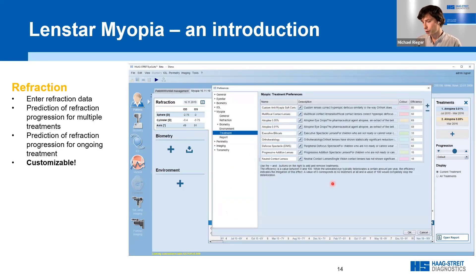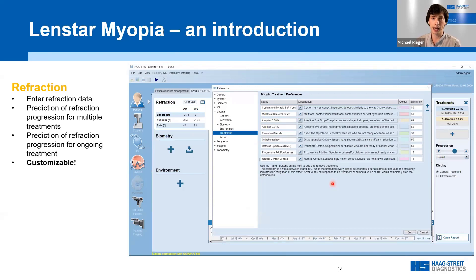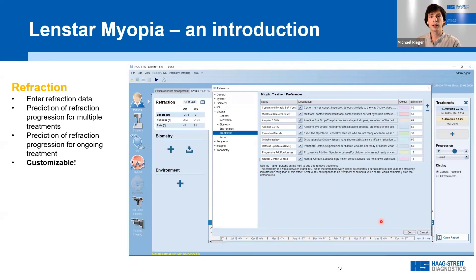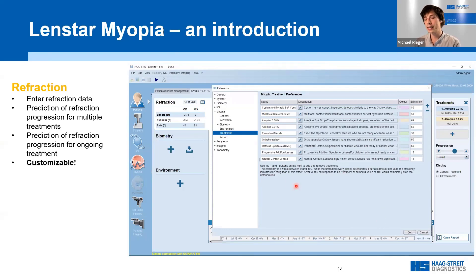The treatment curves come from a customizable list of treatments that can be entered, removed, or updated by the user. Combination therapies — for example, atropine combined with orthokeratology — can also be added, and the efficiency values can be adjusted accordingly. If a new study comes out with a new efficiency number, that data can be directly added into the software.